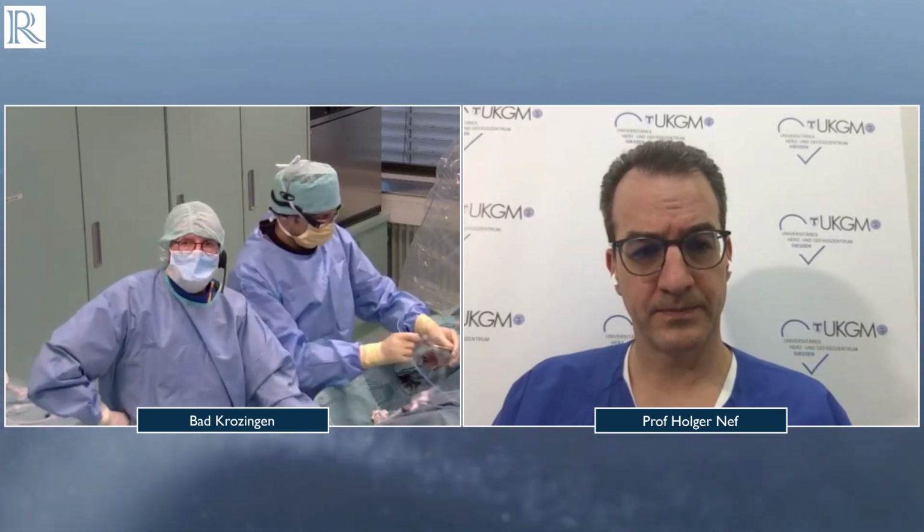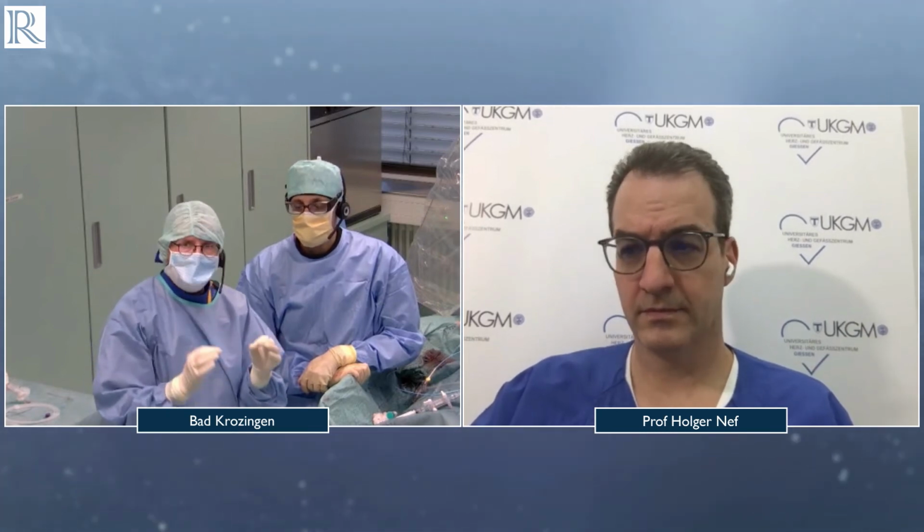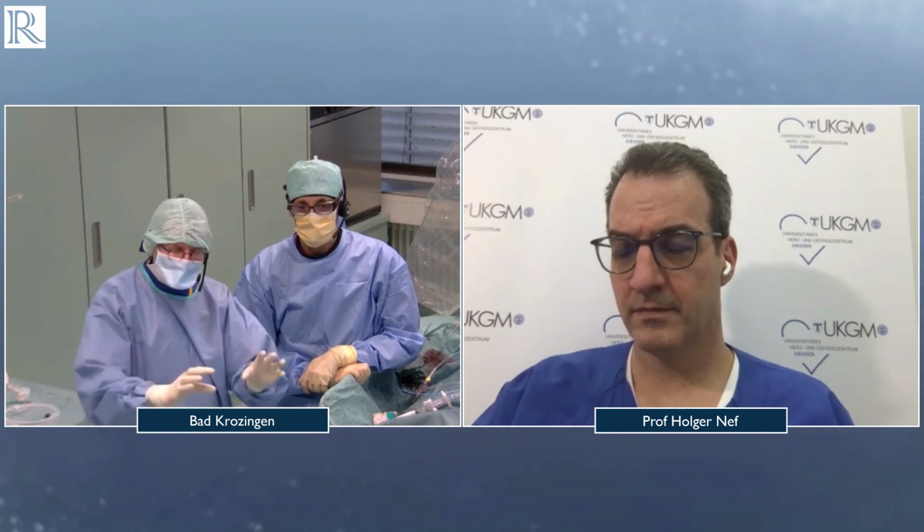Yeah, first of all, Holger, the very clear answer. If you have a subtotal concentric or eccentric calcified lesion, but with a channel below 2.0 millimeters, you have to perform a kind of lesion preparation. So you definitely need a 2.0 millimeter channel to come into the lesion with the IVL catheter.